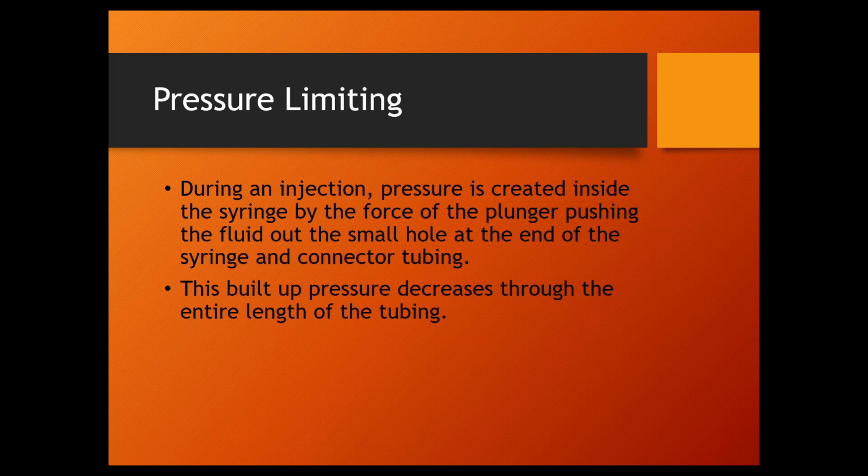So of course we're not going to put 300 psi of pressure in the patient. And some operators don't understand that. They get worried. They'll say, ooh, 300 psi, let's lower that to 200 psi or something like that. That's just going to cause problems. Now, I'll go ahead and bring this up now.